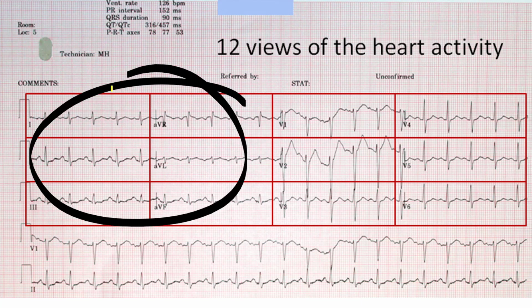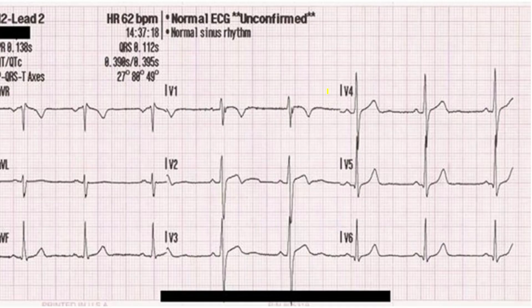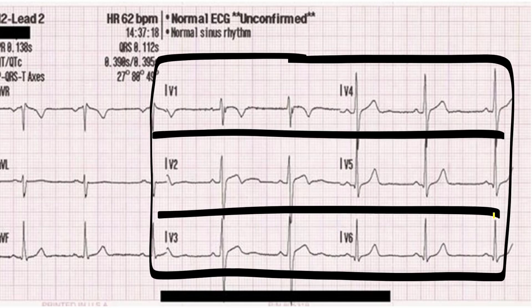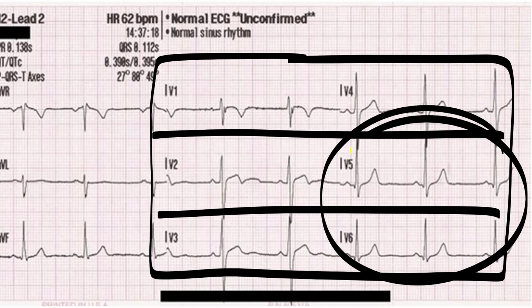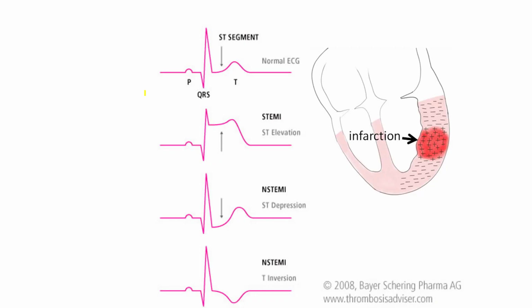And those are typically used to get a better view of the heart, either the right heart, the right ventricle, or the left heart, and even sometimes the bundle branches. So this will tell you a little more information. When you become an ECG expert, you can tell things related to the atria and the ventricles by using these 6 leads and these 6 views, which sort of shift from the right side of the heart around to the left side of the heart.